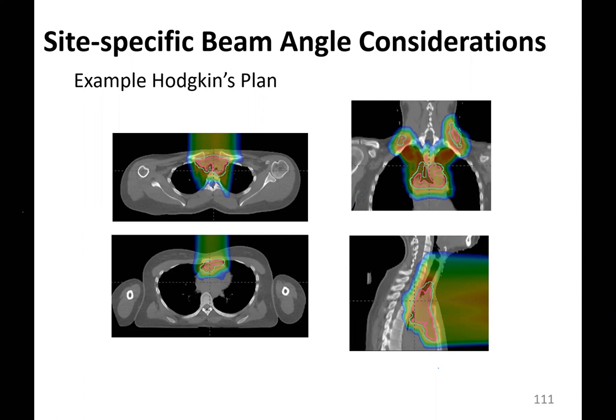and the planning is CT planning. Okay. After this planning technique, I'll go on to some uncertainties and show you how we can use the CT. For proton, we are not using Hounsfield units, but we are using a stopping power ratio. Okay. I think that's the reason some people are asking.